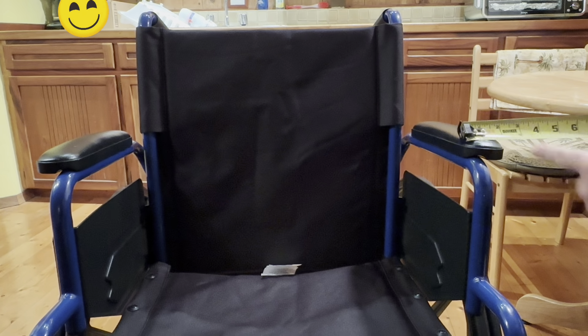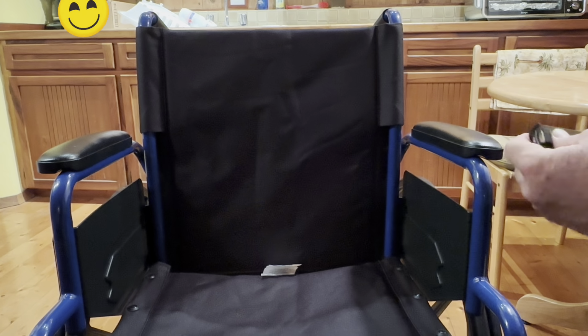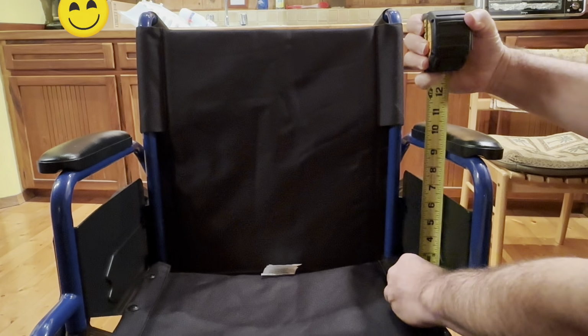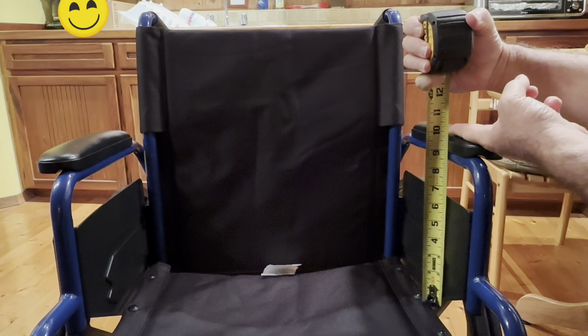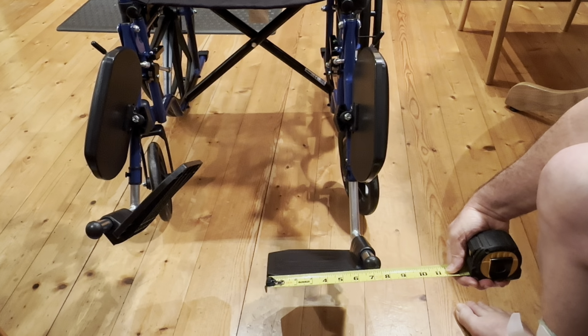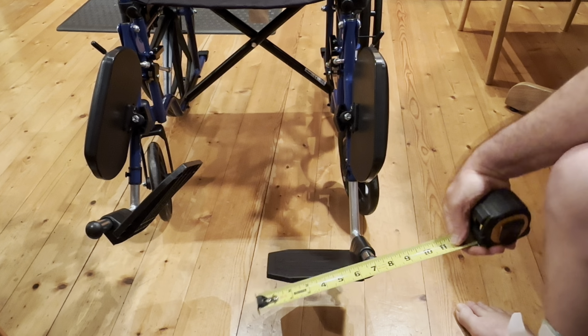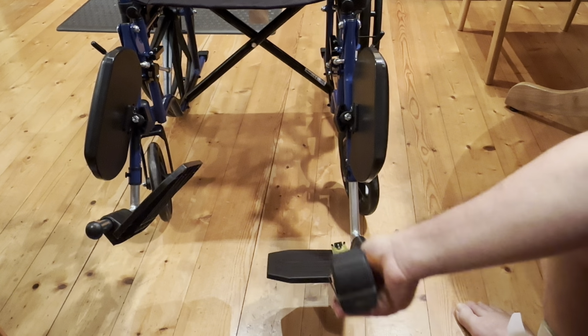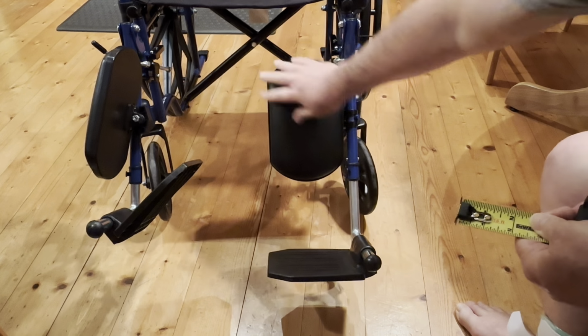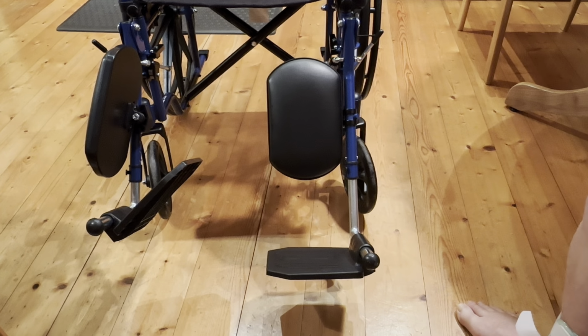Okay, and there's some other things maybe you're curious about. These armrests are about 2 inches wide. The armrest is about 10 inches long. The armrest is at 10 inches from the top edge of that seat. The width for the footrest is about 6.5 inches by about 6 inches, so it's almost a square. Leg cushion is about the same, pretty similar.